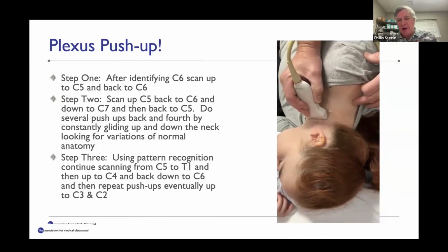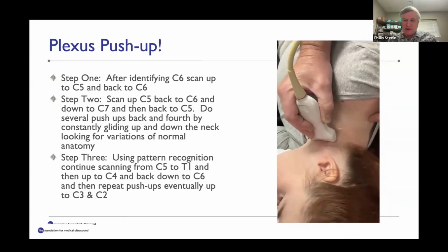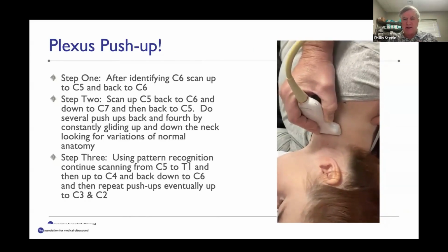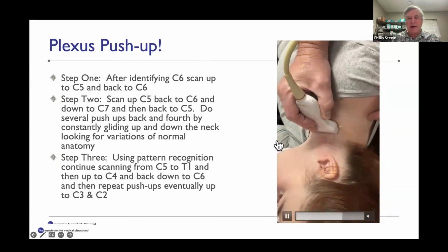I talk a lot about what I call plexus push-ups, and I've taught numerous workshops where people just lay a probe on and take a single image, and then they send me an image, and I'm like, what is this, Dr. Steele? And I'm like, well, I don't know. Can you send me a video clip? And so it's really these video clips of going through this terrain that can be really helpful. So here I'm just sort of scanning up and down.